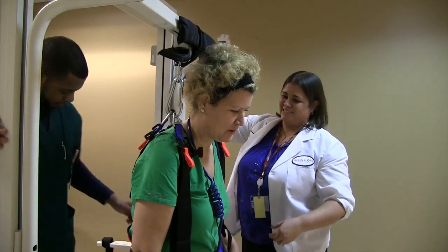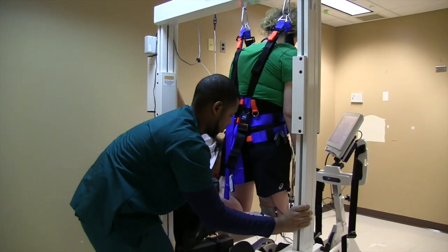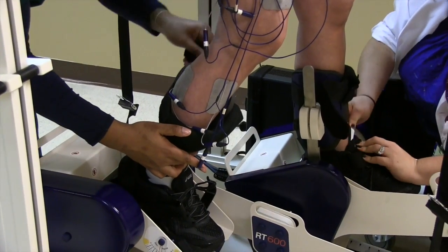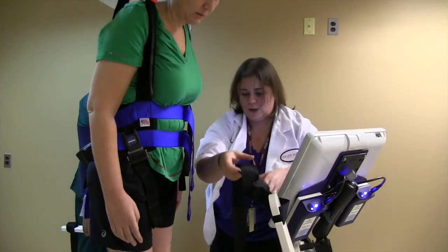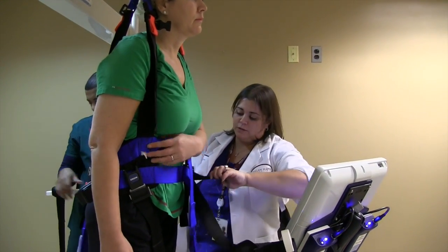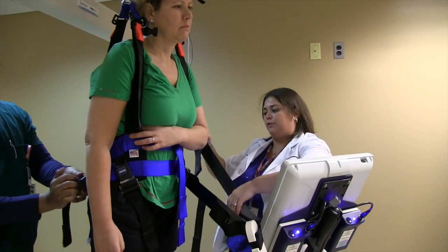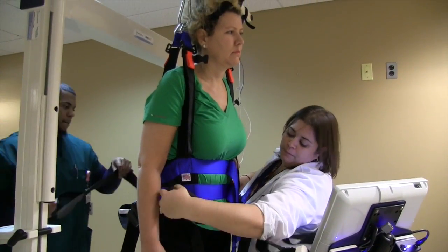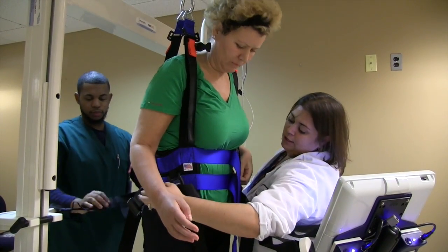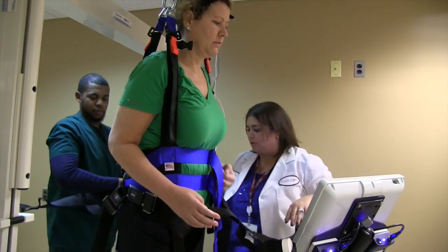I get to feel like I'm on Broadway. We're going to hook up the hip guides to give Britta four additional points of support to prevent too much side-to-side lateral sway or too much front-to-back sway. It helps to keep her posture in place because now she's walking without an assistive device, and she'll be able to get that reciprocal arm swing.